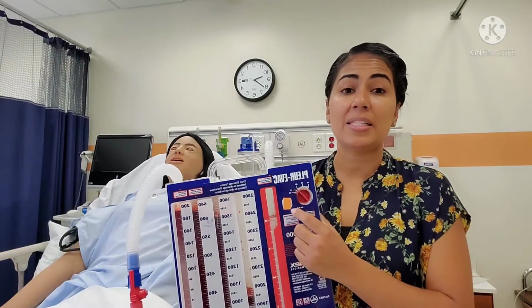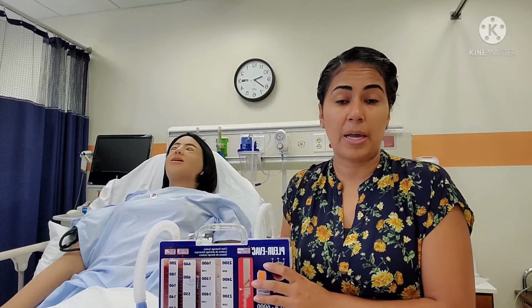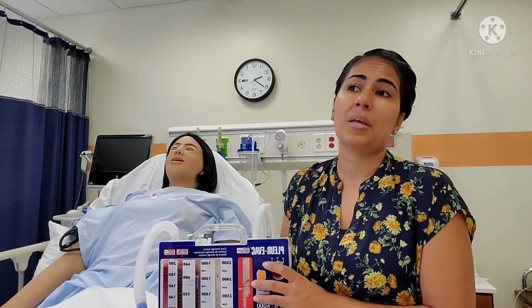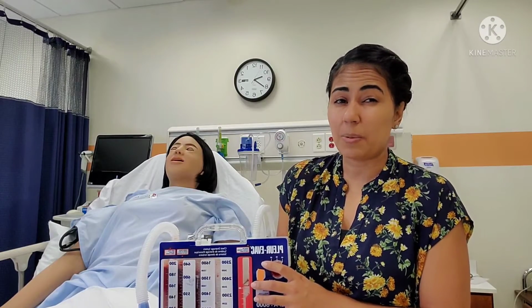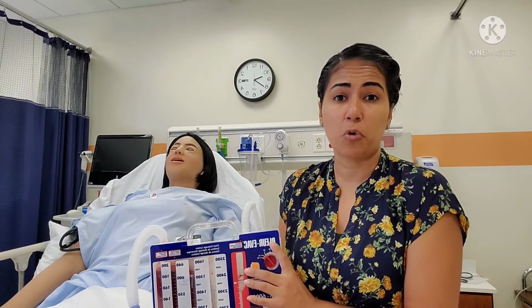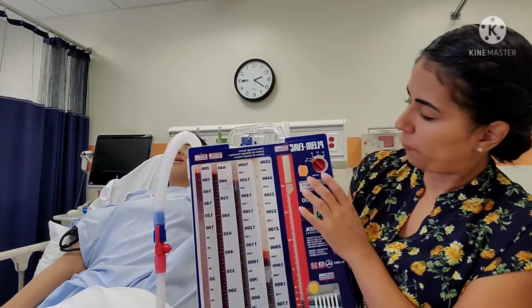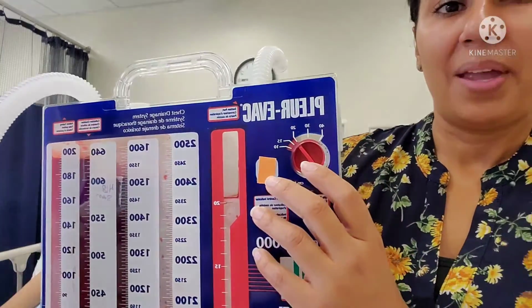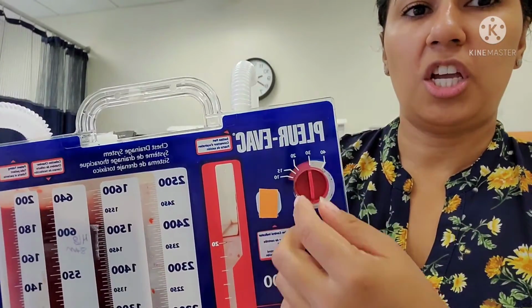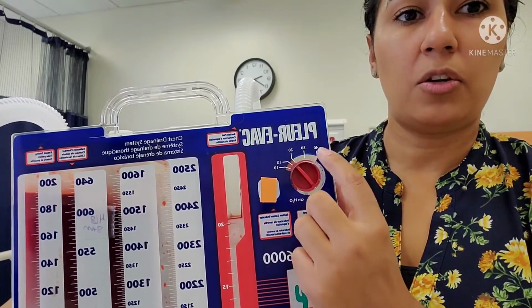And what I want to see is that if my provider ordered suction, I'm suctioning at the correct amount, okay? So I'm going to look at my provider's order. Oftentimes, in my experience, it's been 20 centimeters of water. If you look at this system, it goes from 10 to 40, but typically my provider has always ordered 20, okay? So the first thing I'm looking at is my dial. And my dial here is set to 20, okay? You can see that I can change it and set it to 20. It's 10, 15, 20, 30, 40, okay?